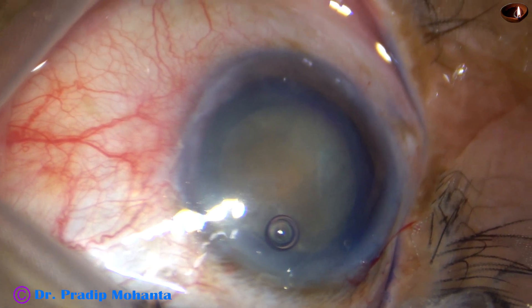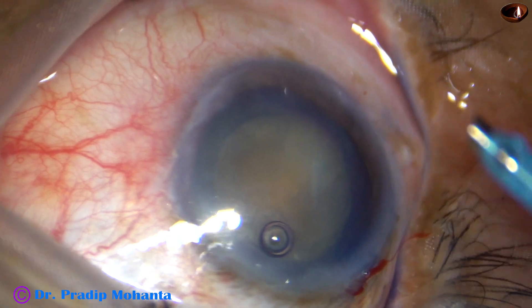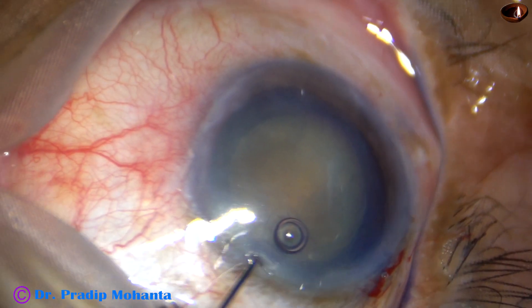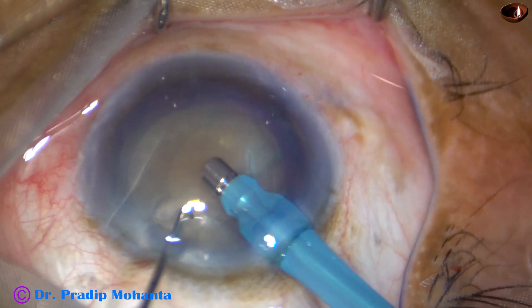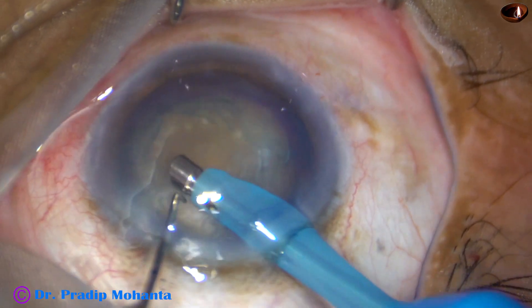In this case, peribulbar block has been given and the eyeball has turned to the right side. It has been very difficult to manage this case. So every time I have to keep the eyeball straight by some pull, some force.